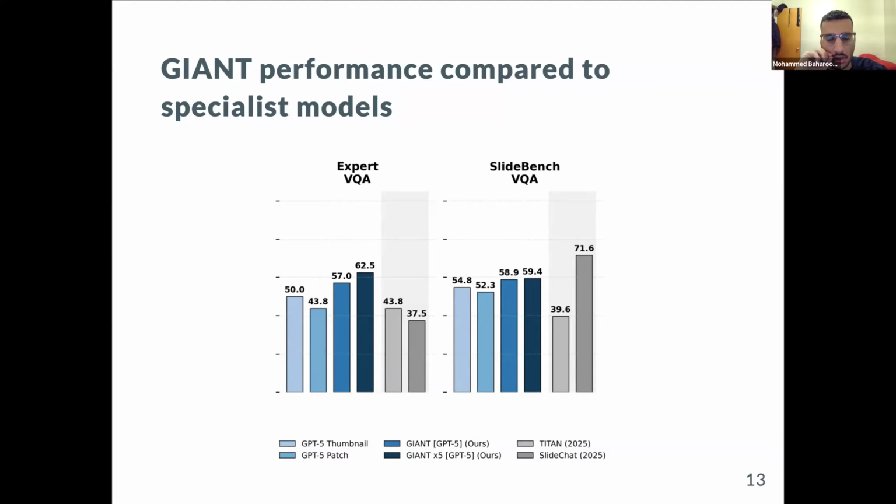So you can have CONCH, and a bunch of others, and then you can make the orchestrator GPT take in all of the predictions from each model, and tell it to use that to help its final prediction. So something like that could also be done here.